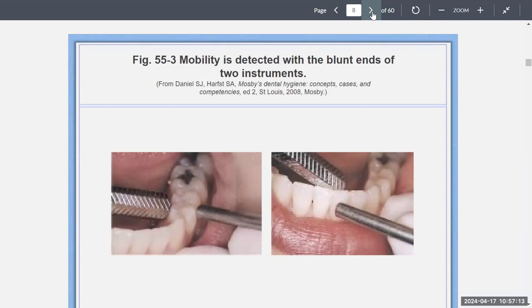This is how we detect if there's mobility in a tooth. You can see here they're using two ends of an instrument — usually the handles. You don't want to use your fingers because your fingers kind of move and it's hard to assess. With two ends of an instrument you can assess better and go back and forth to see what is the mobility class of the tooth.